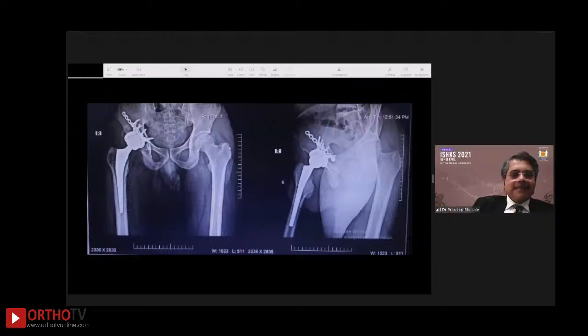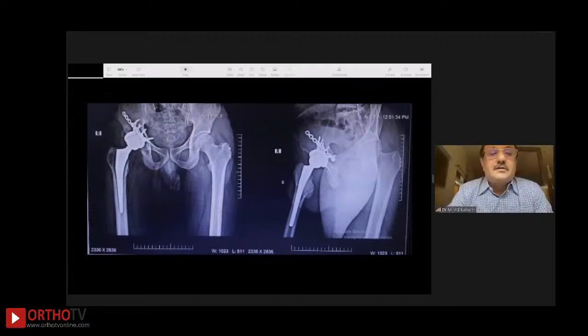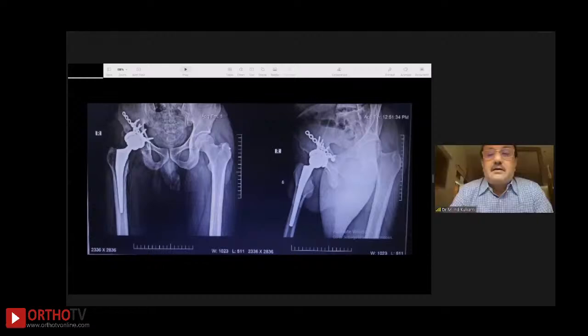Excellent case. Excellent. Thanks, sir. So you removed one plate, right, Milind? Yeah, that is the only thing which comes in the way. Okay. Fine. Even I had kept the implant cutter ready. If it's coming away and I cannot remove it, I can just cut that portion of the plate.